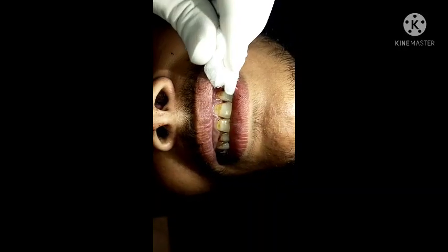Hello dear students. As a part of clinical nursing, every nurse should know how to suture in an emergency situation. I am going to show you a suturing procedure where you will get short knowledge about suturing as well as how to suture in this situation. So without wasting your time, let's begin the procedure.